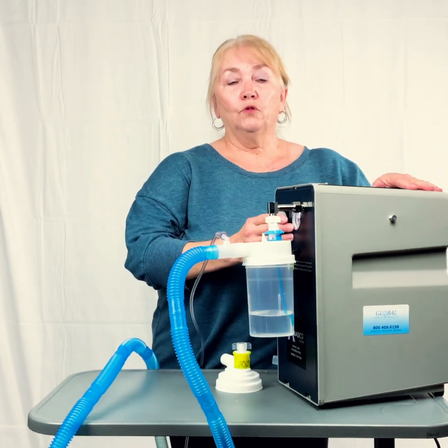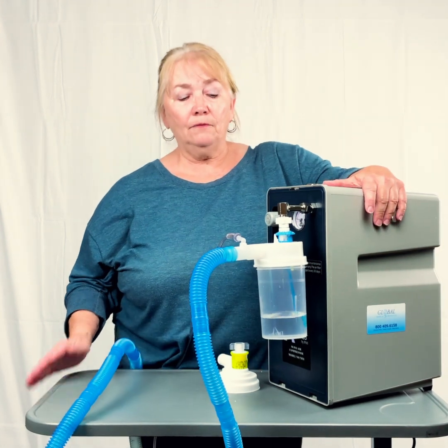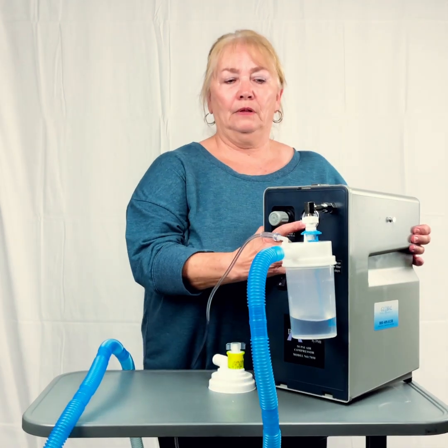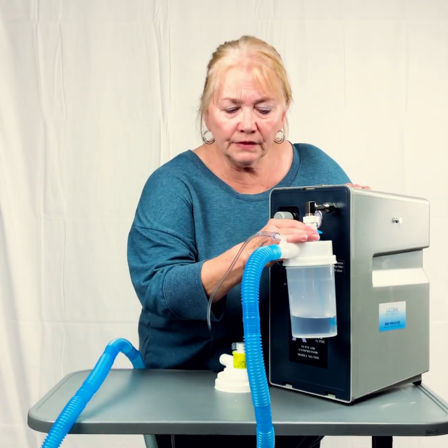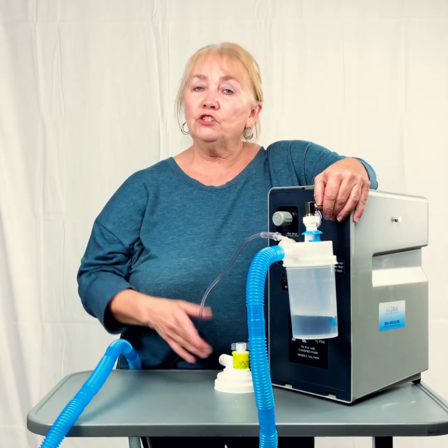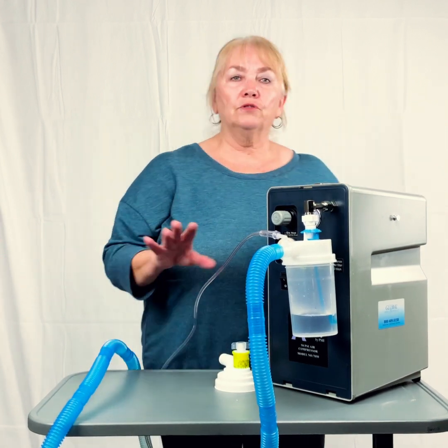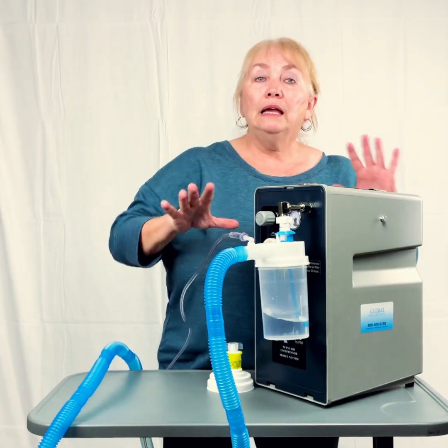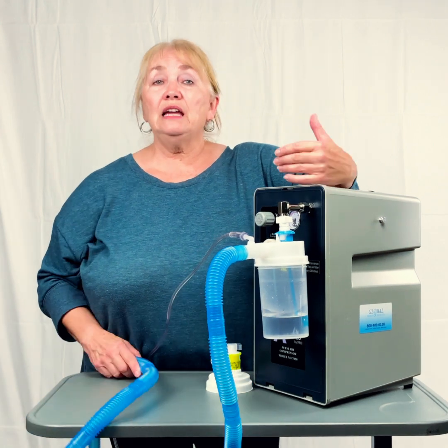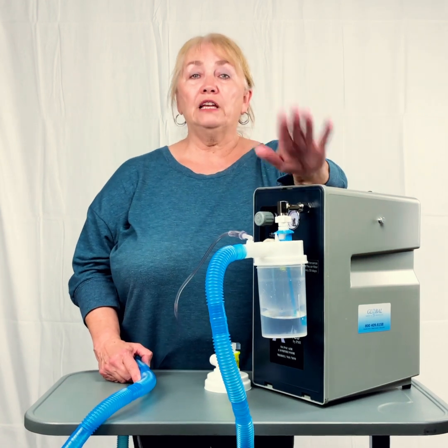So normally, what we do is when the technicians come out, the gauge on the compressor is set at 40. The number here is set at 40. And then if they're on oxygen, the oxygen is set at 4. The oxygen can be turned up and down by nursing or family, whoever is administering that oxygen. That's just an easy way for us to set it up so everything gets set up the same way. So it's 40, 40, and 4.